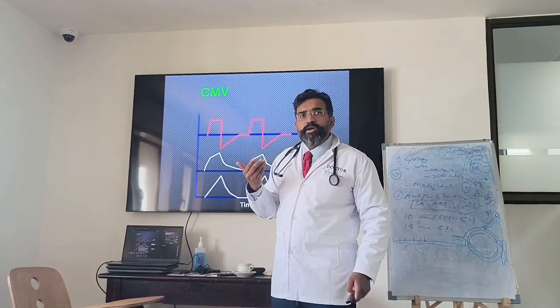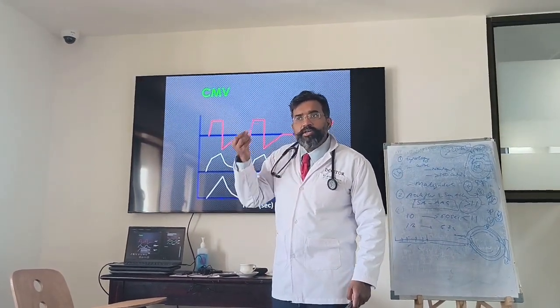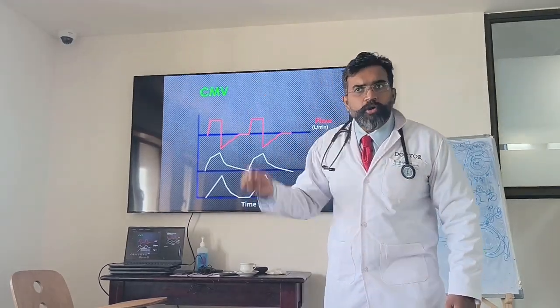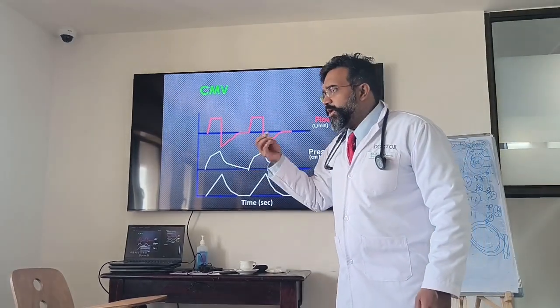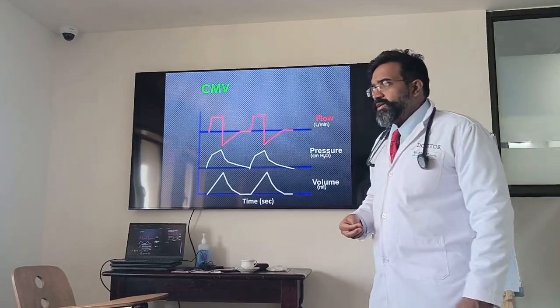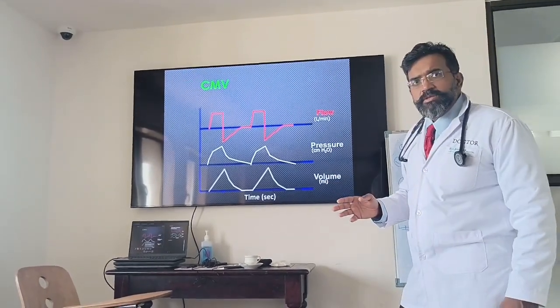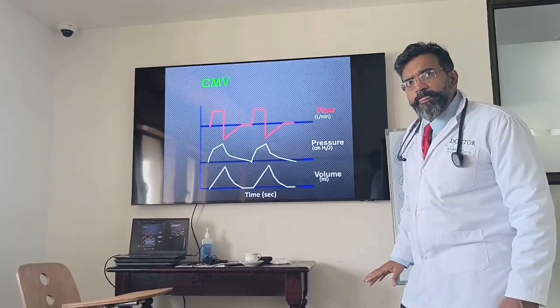So what do I have to monitor here? I should be monitoring my pressure. I should be monitoring my peak pressure. I should be monitoring my plateau pressure, because this is not under my control. Clear? That is a variable. Clear on this? Understood this mode?